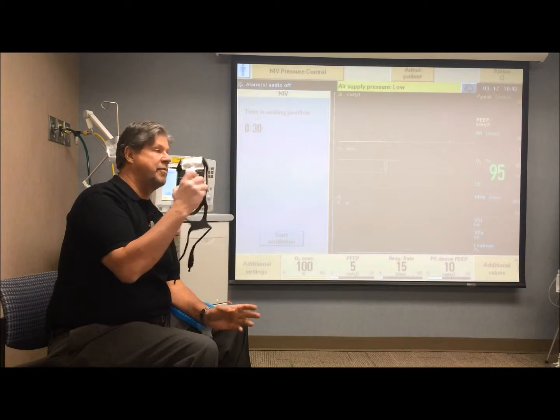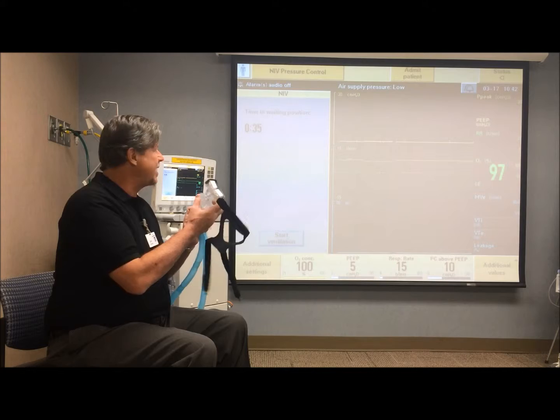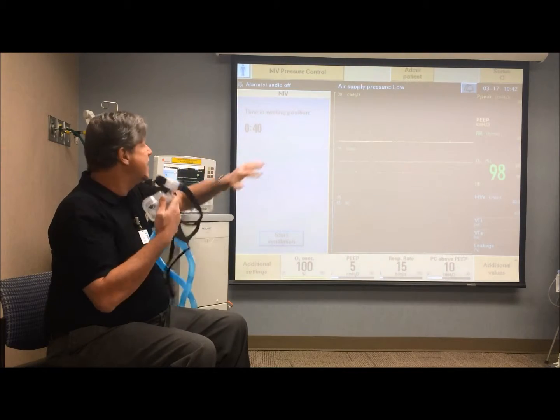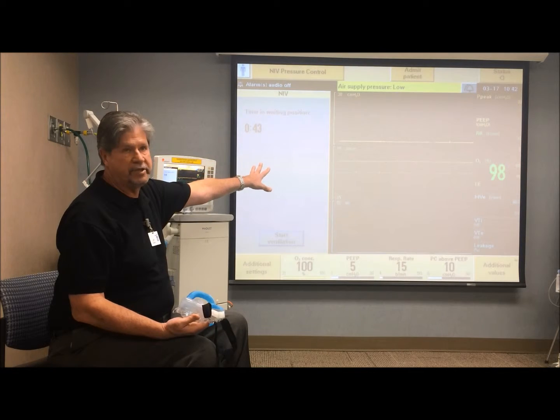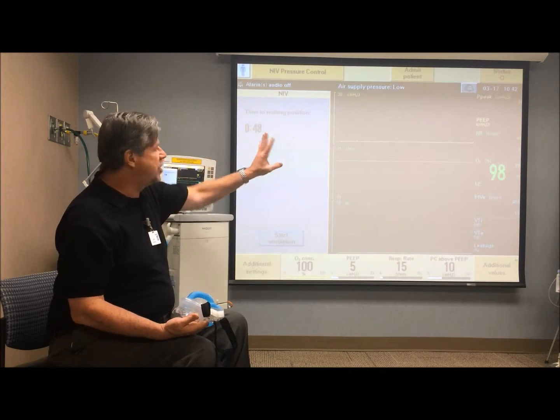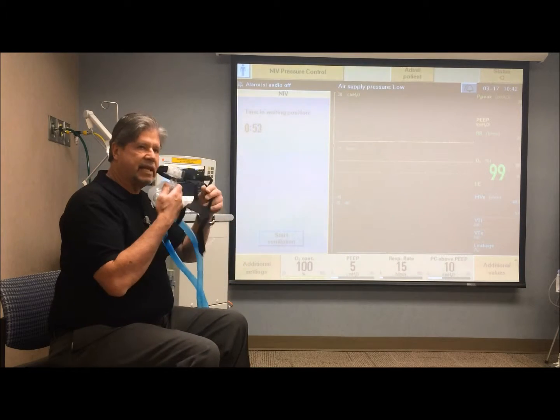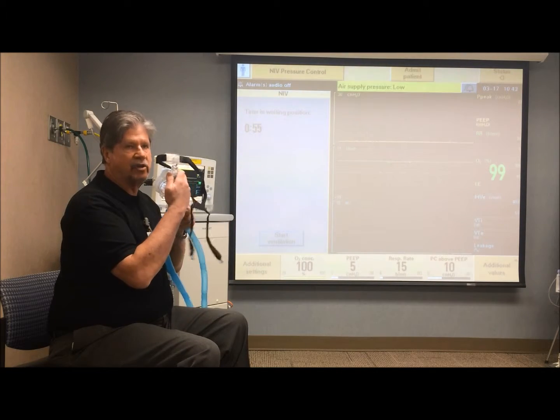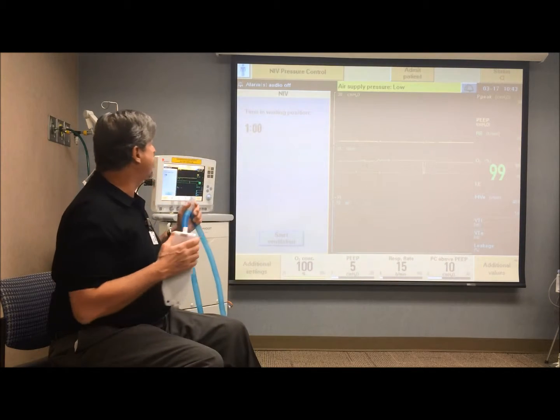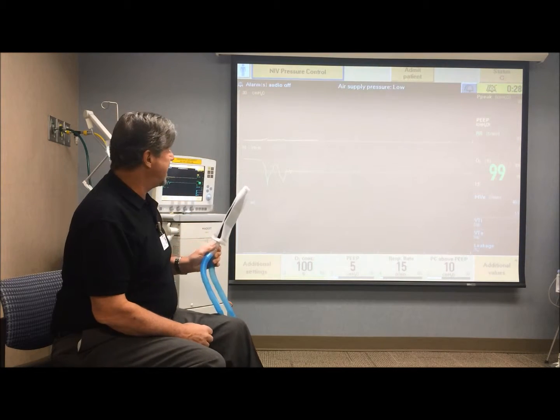Smith, and you see this mask coming, you get a little apprehensive. So before you get the mask and everything going, the ventilator allows you to deal with that and get this all ready by going into what's called the waiting position. No alarms other than that air pressure that went off. No alarms, no blowing of gas, nothing going off. So now you have time to get things ready and to casually go and start ventilating Mr. Smith. Once you get an appropriate seal, the ventilator will recognize that and begin to ventilate.